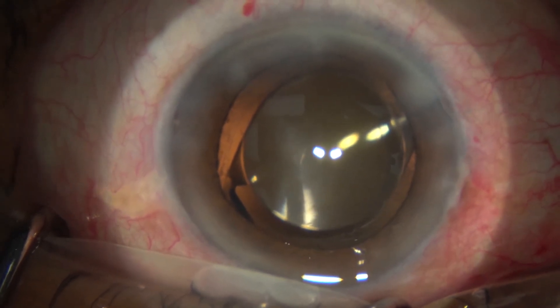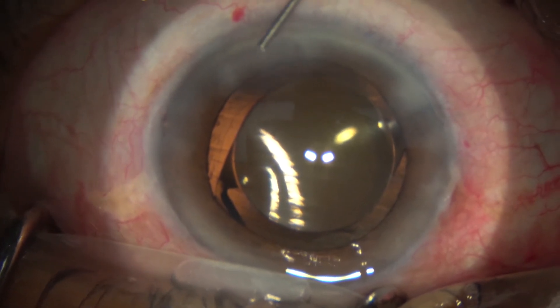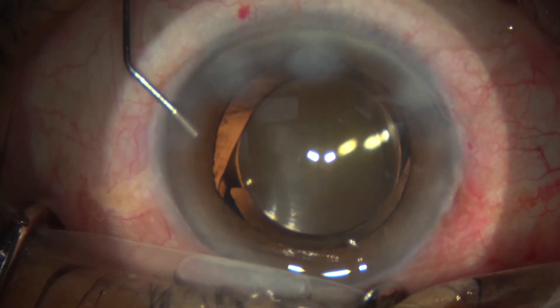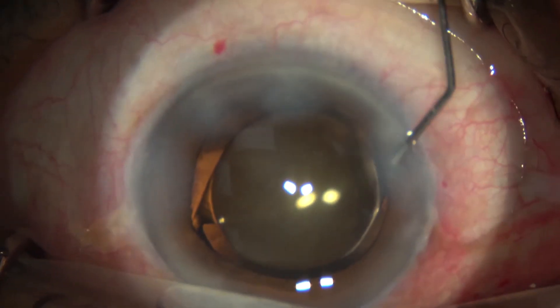Coming to the end of the procedure, we use more BSS — balanced salt solution — to go around and seal all the wounds. We check the wounds with a sponge for any leaks at the end, and then right at the end of the procedure we inject a sub-conjunctival cefazolin antibiotic and dexamethasone steroid.